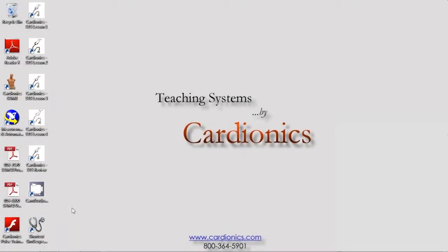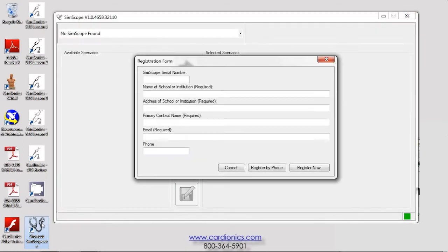Locate the SimScope icon on the desktop and double-click. The registration window will appear requesting information for warranty purposes.